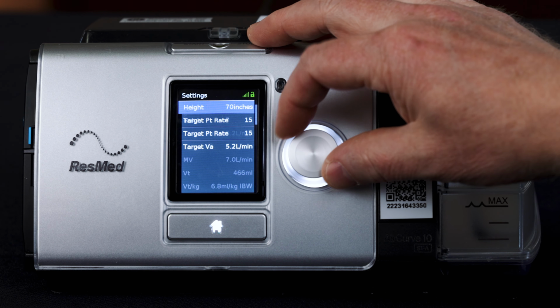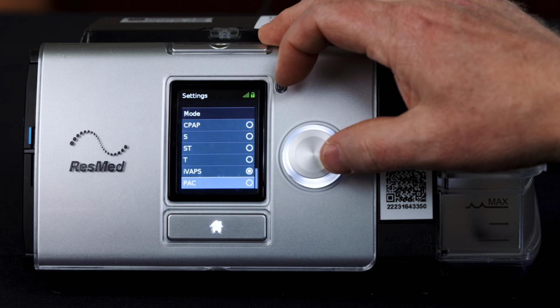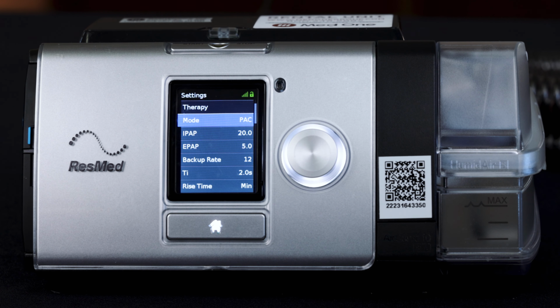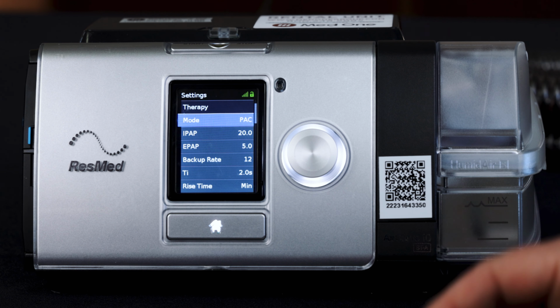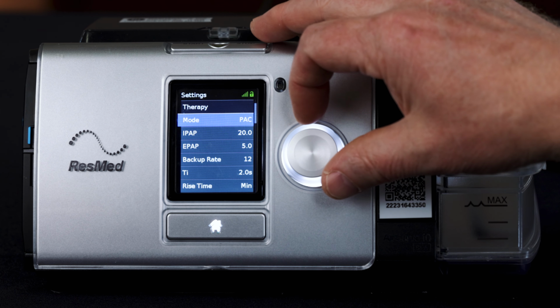Then your last mode is pressure assist control. So this is basically a mode where you're just delivering pressure. You have an IPAP pressure setting and an EPAP pressure setting, and then you have a backup rate, which again, you'd want to always be greater than 8.